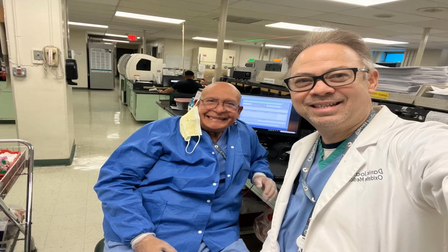So once again, if the person that is taking the blood in the pre-examination area does not follow the protocols, well, that blood test result that the doctor received does not represent your metabolic levels. And in order to avoid that, the person has to follow, once again, CLSI guidelines and protocols found in the GP41 document.